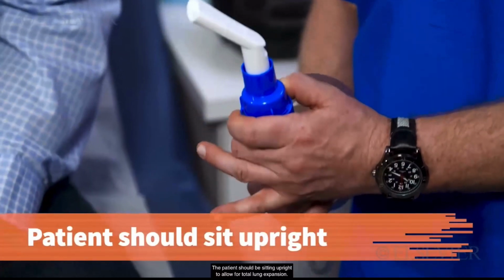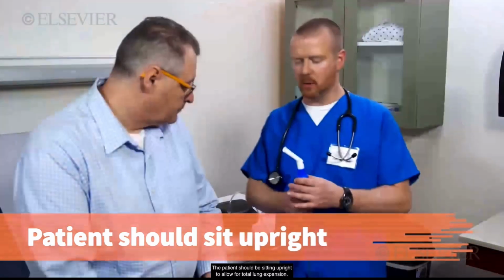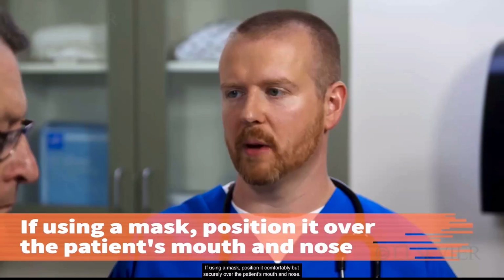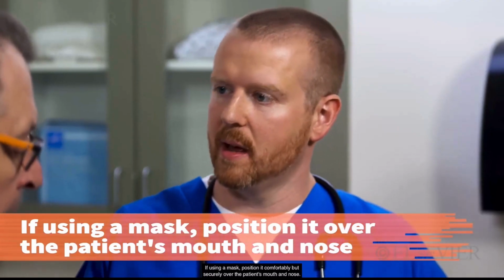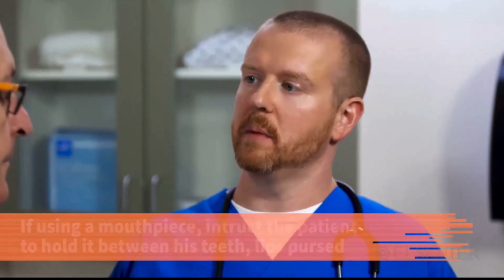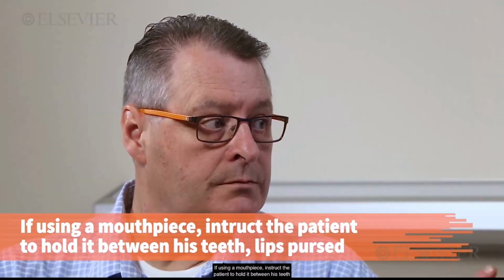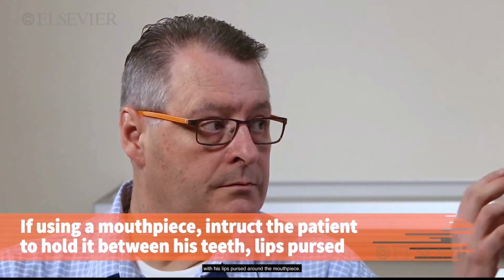The patient should be sitting upright to allow for total lung expansion. If using a mask, position it comfortably but securely over the patient's mouth and nose. If using a mouthpiece, instruct the patient to hold it between his teeth with his lips pursed around the mouthpiece.